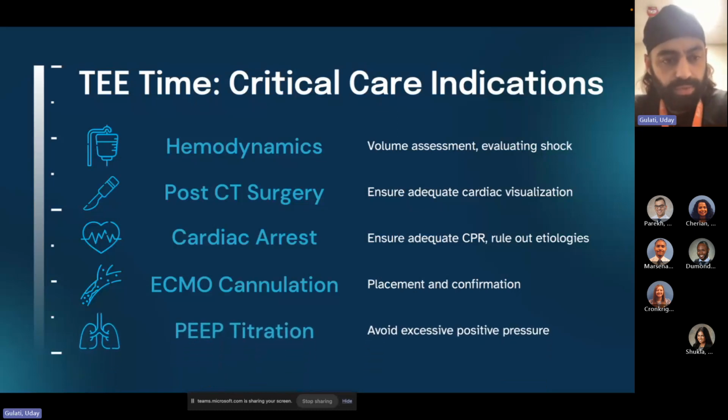It kind of goes hand in hand with what we just talked about in resuscitation. But even like managing a patient on a ventilator, right? How many times have you put a patient on a ventilator who's dealing with hypoxia, made some vent changes, for example, put them on APRV or higher amounts of pressure, patient goes into a shock state, you're concerned about overdistension, you're not able to get good transthoracic views because you're hyperinflating their lungs.